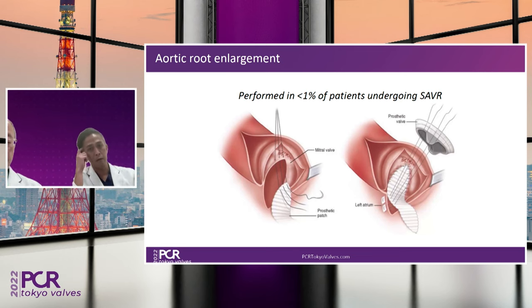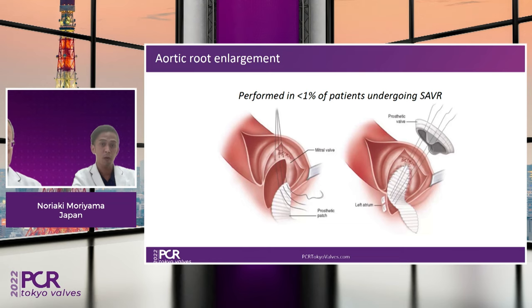Okay, thank you, Dr. Shigeru. And I think in terms of surgical aortic valve, durability data over 10 years has been already reported. However, a small annulus requiring a small surgical aortic valve results in, I think, a significant PPM leading to worse hemodynamic outcome in early phase, even with externally mounted leaflet surgical aortic valve. So I think aortic root enlargement may be a potential and good way of mitigating the risk of PPM after surgical aortic valve replacement.